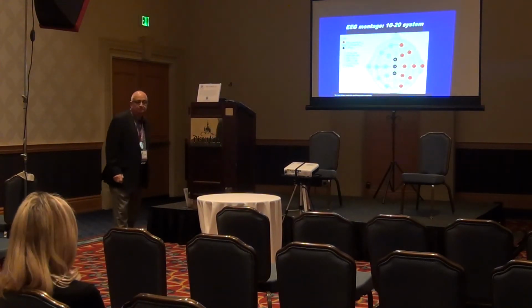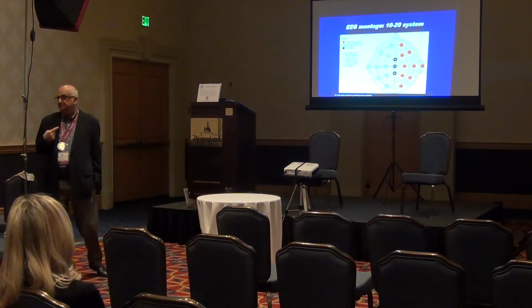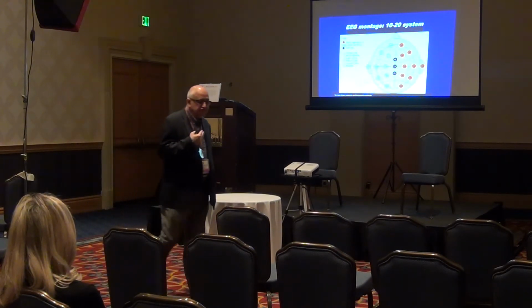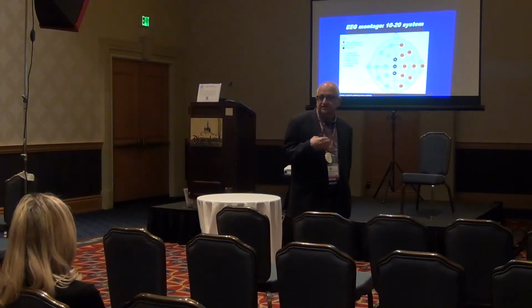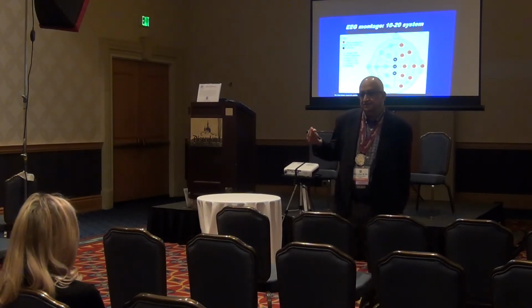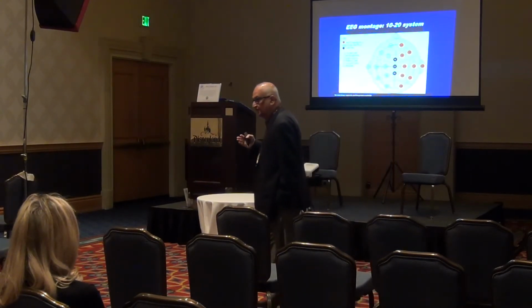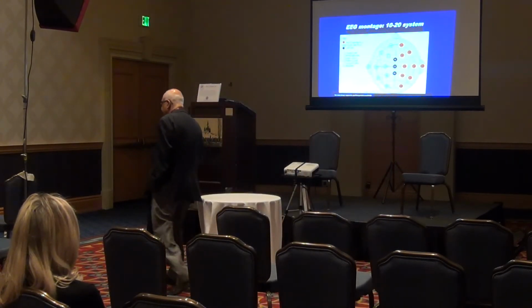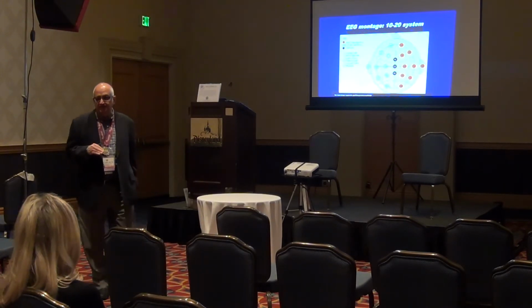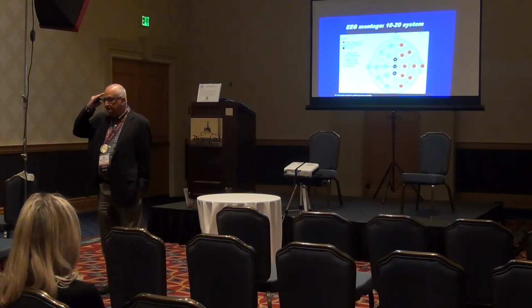So the basic components of the EEG. When we talk about EEGs, we often use words like, I see some activity in the electrode T3 or T4 or T5. It sounds kind of mysterious, right? So that part is fairly easy to understand. The way we number them is, everything on the right side of the head has an even number.